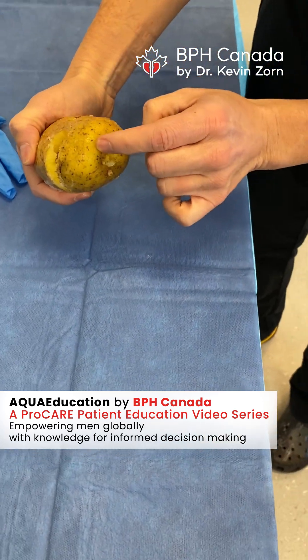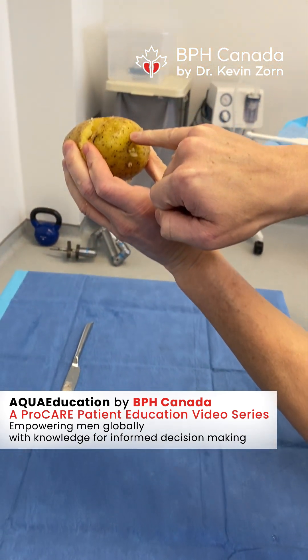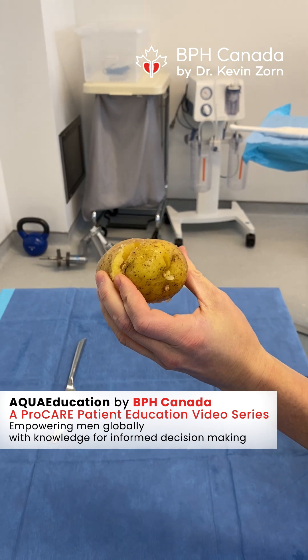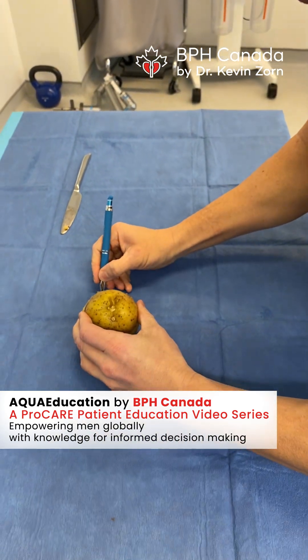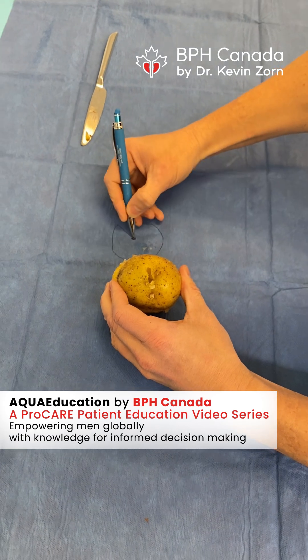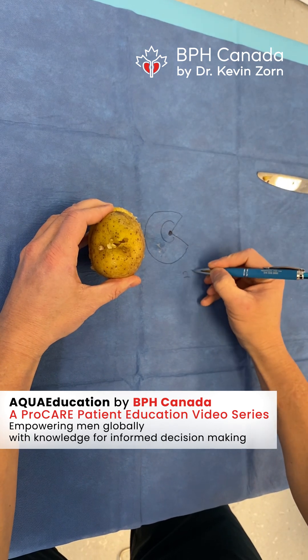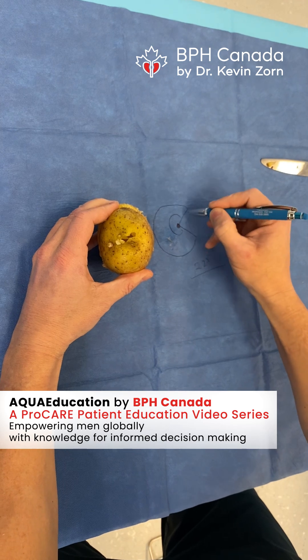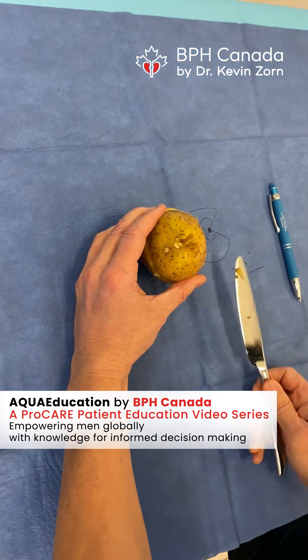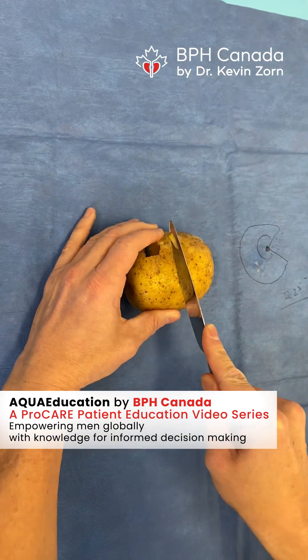This was our potato where we had our scope come through — that was our center point. As you can see, rather than being dead center, it was up on the upper end. Since my design — this is a potato — and how I drew it, here's my axis. You saw on the TV screen before our defect, and the maximal rotation back and forth is 225 degrees. Technically there's some leftover tissue — we'll use a loop and get that after. Did we create that? So I'll go ahead and slice this mid-prostate and we should see exactly that kind of defect.